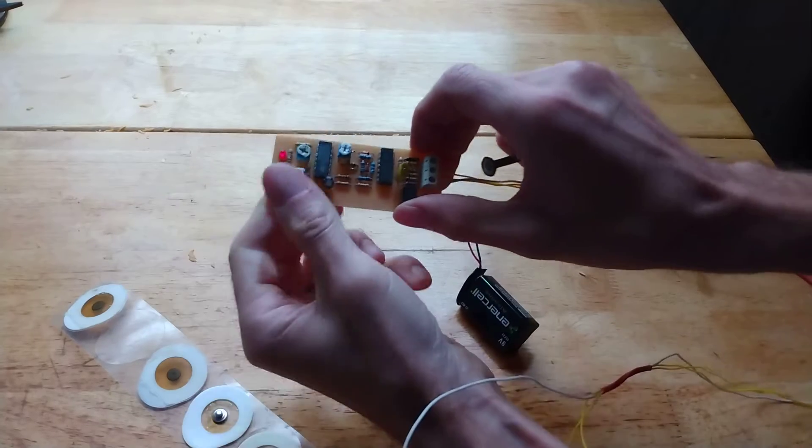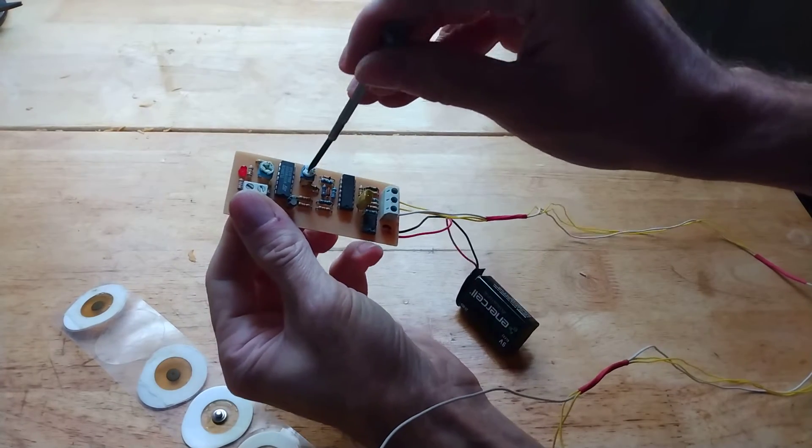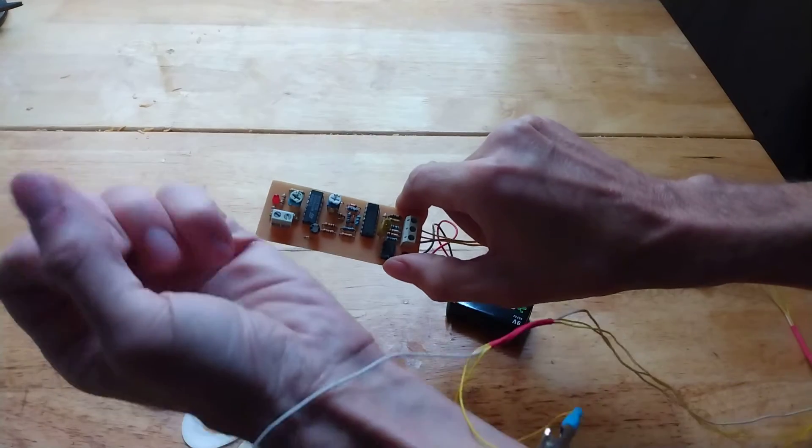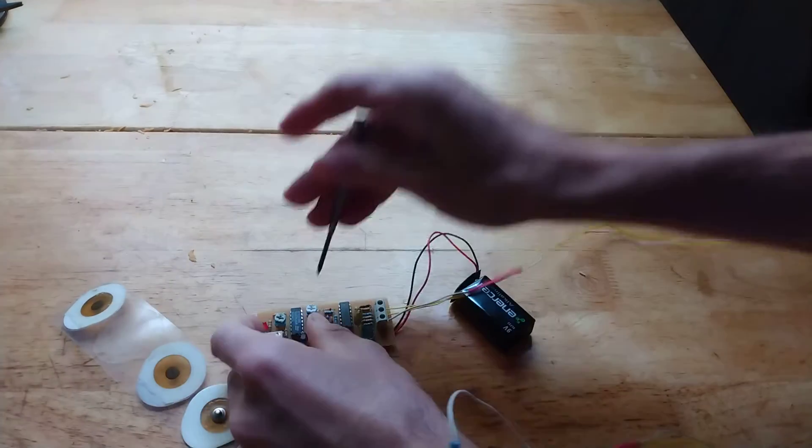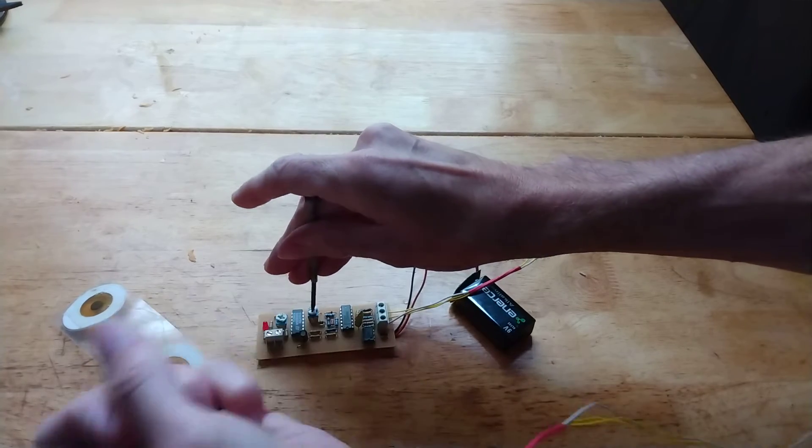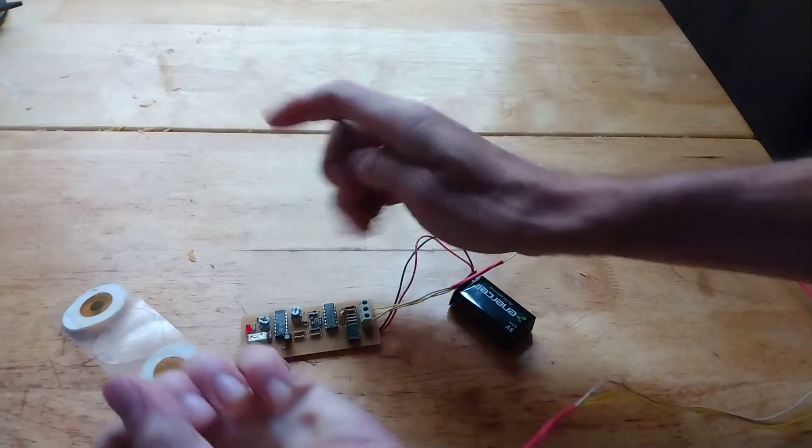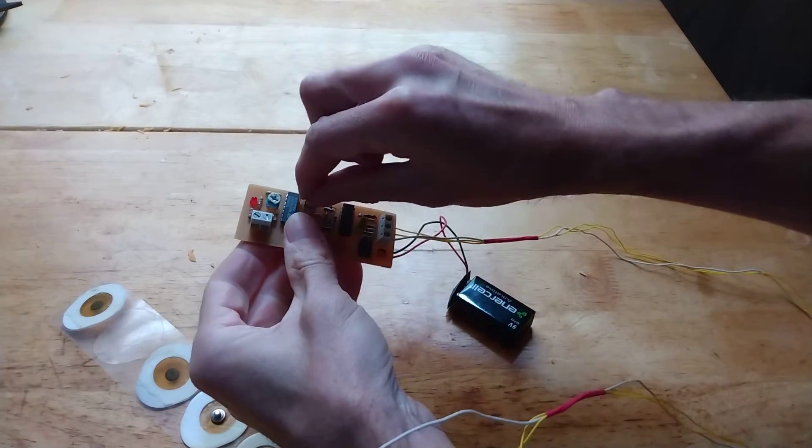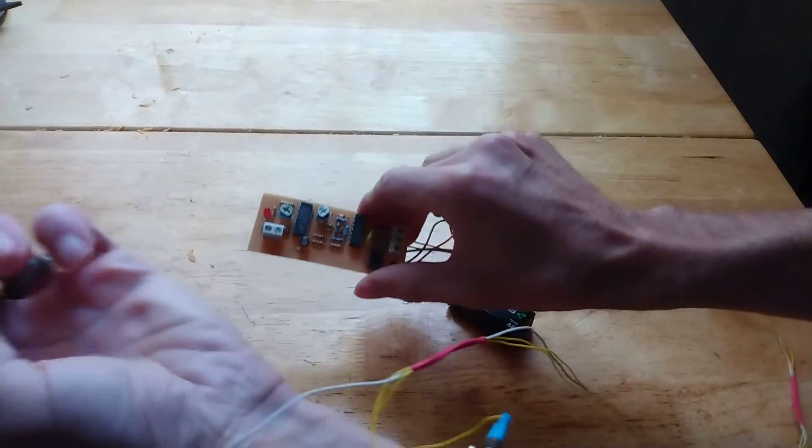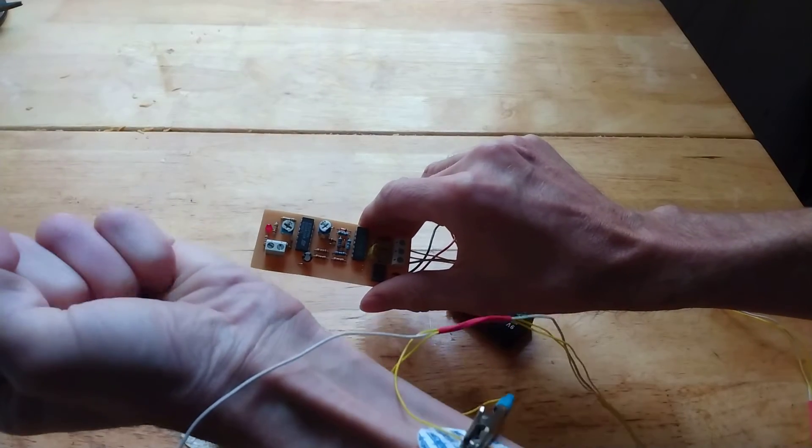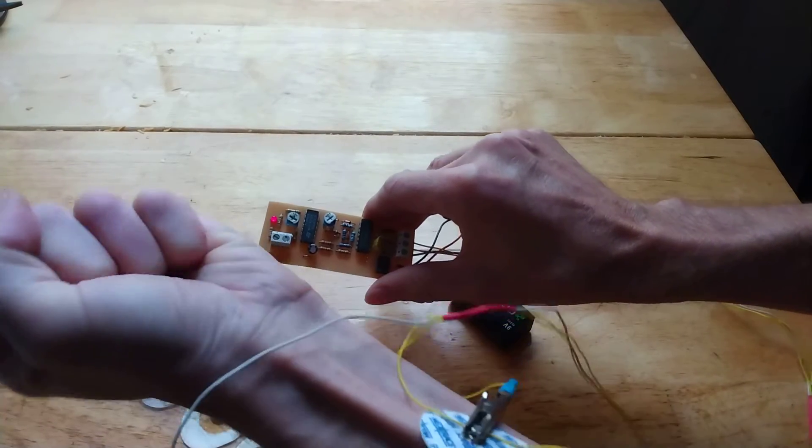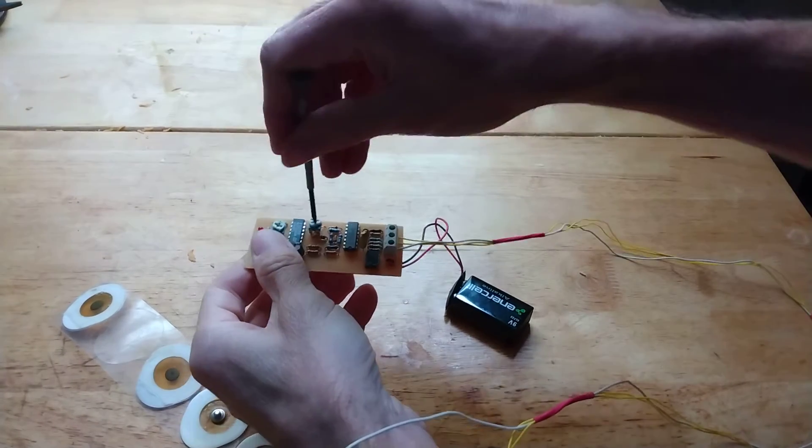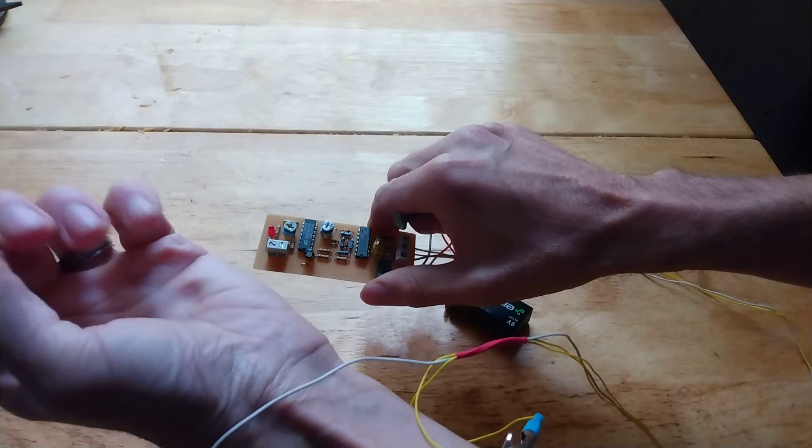This other resistance controls the gain of the circuit. So here I need - if I decrease it, I need to contract way more in order to turn on the LED. Maybe a little bit more gain. I see I have to contract really hard now, but we can control that gain. Now I don't have to contract as hard. See, so the circuit works.